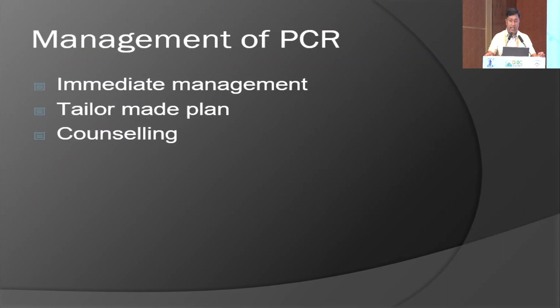Management of PCR requires three things. One is the immediate management. Then you require a tailor-made plan according to what is left behind inside the anterior chamber. And third, and the most important thing, is counseling.